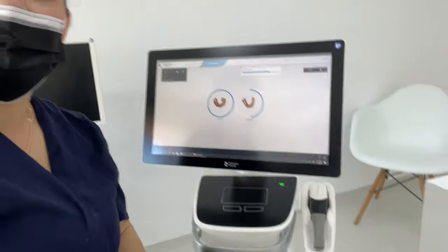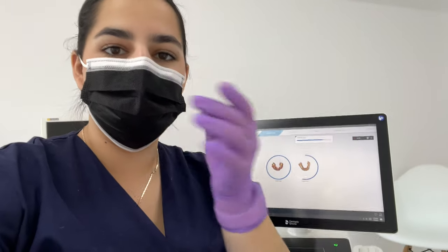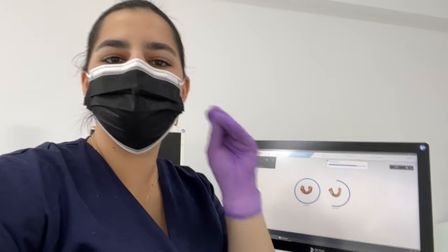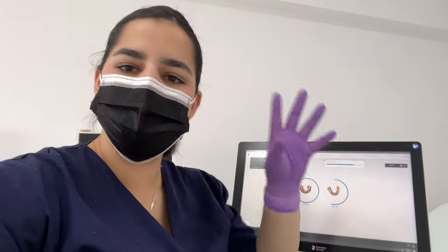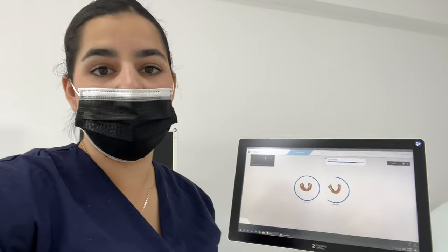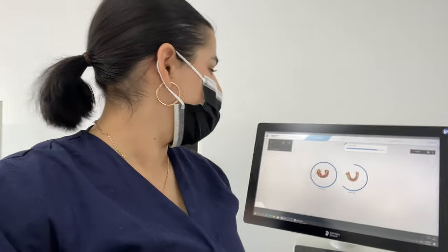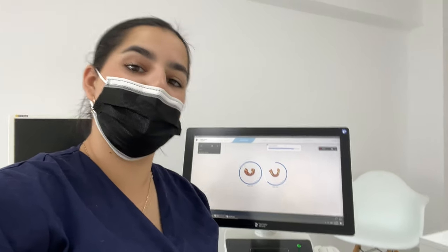So we are done now with the scanning, and we're going to let it process. As you can see, it's processing very quickly, it's been just about 1 minute, because we didn't scan that much. When you scan, it's good not to stay a lot with the camera on the tooth, because it's very smart, and the longer it stays, the more it captures, and it takes more time to load, and either way you don't need those details. So now we're waiting to export, and we're going to take you to the next step.